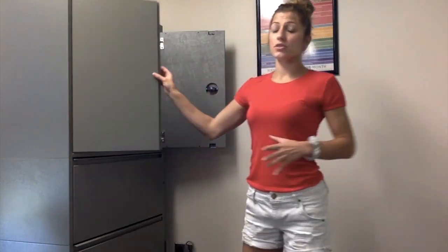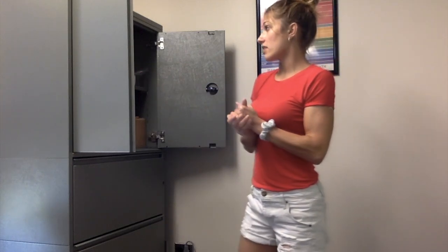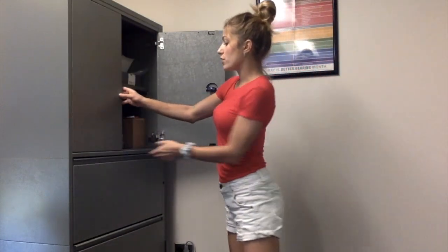On the opposite side of the room, you'll find the file cabinet, which has all the supplies that you might need to replenish out here. You have your gloves, your hand sanitizer, more specula, more probe tips, etc.